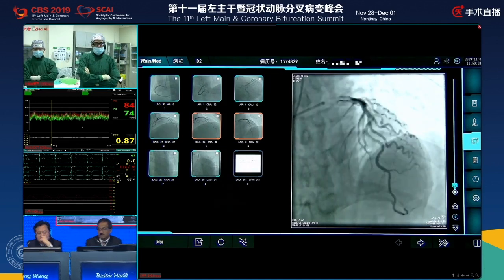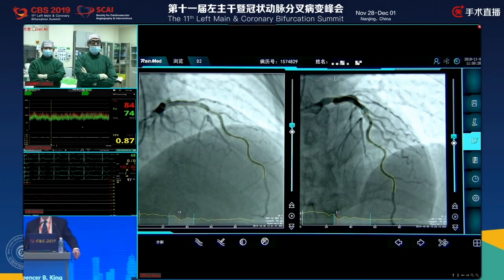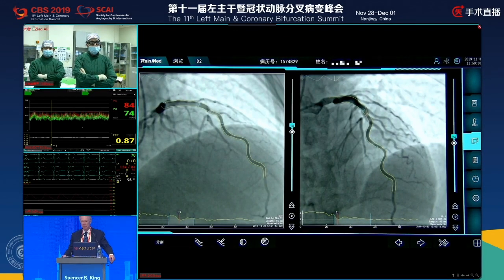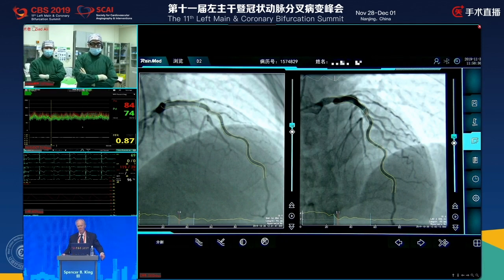Is that a problem with it? Well, it can and can't be, Spencer, because the angiogram, once you try to use the assessment, will tell you whether or not you're able to use it. So here what we've done is gone ahead and selected 2 angiograms, and what my colleague will do is show you how we perform the segmentation.